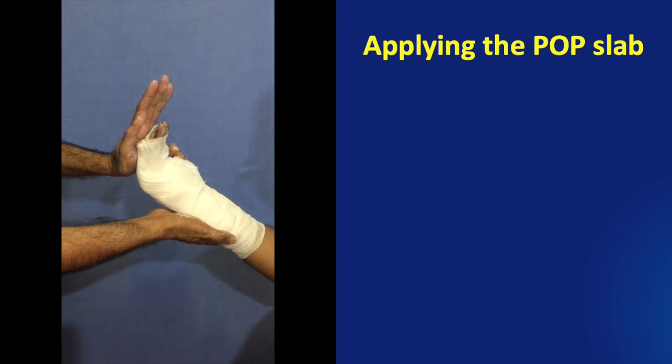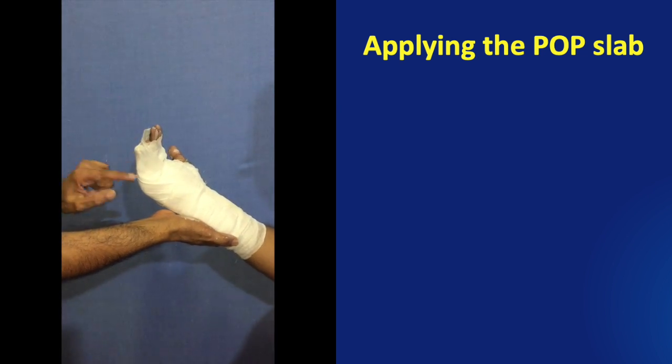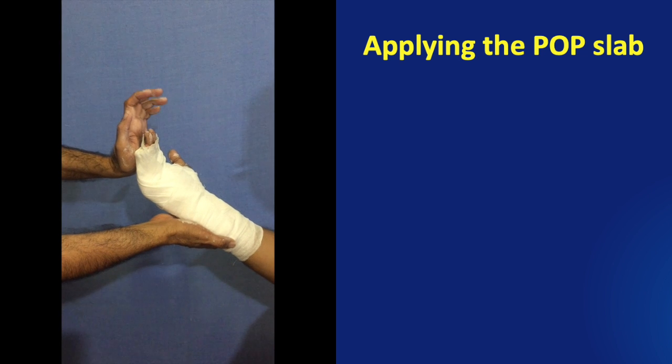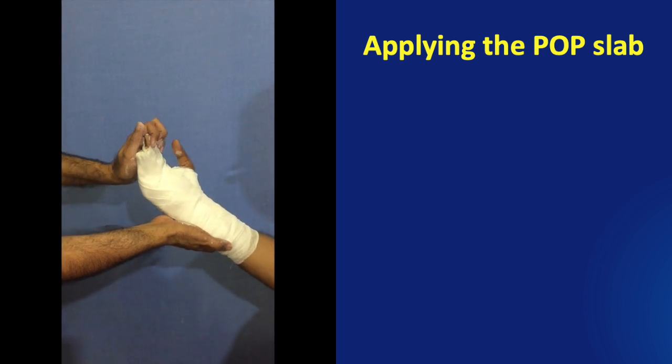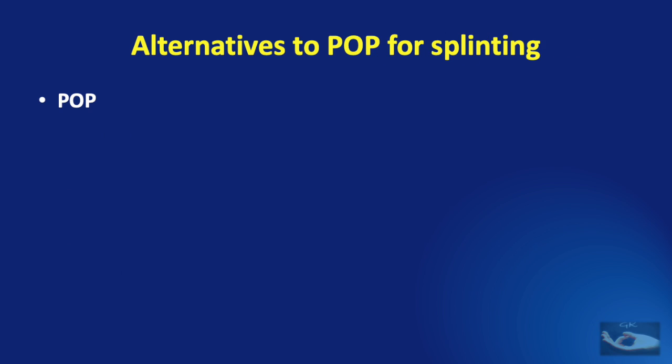After it has set completely we must apply another layer of bandage to make it neat. This bandage is secured with a sticking plaster. So now we have understood that immobilization of the hand is a very important step before managing the hand injury. And we have seen the method of immobilization using a POP or a plaster of Paris.